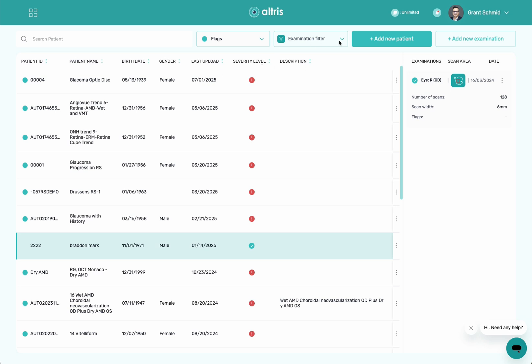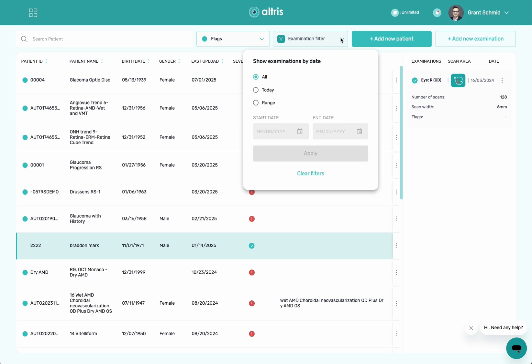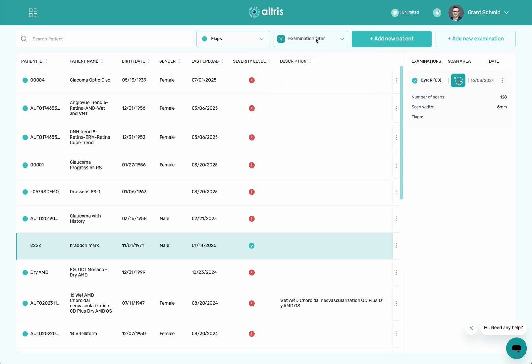You also have the ability to choose additional filters up here, which you can sort by today, by range, as well as sort by physician.